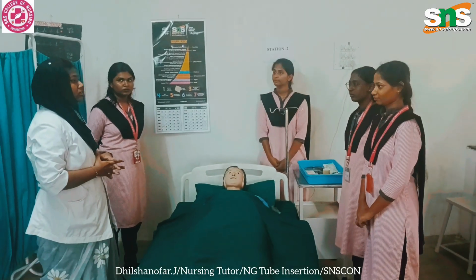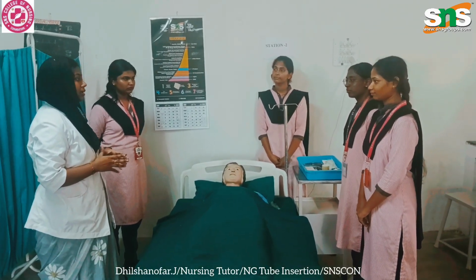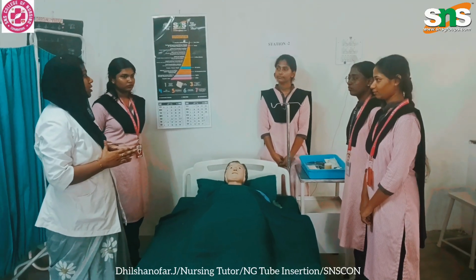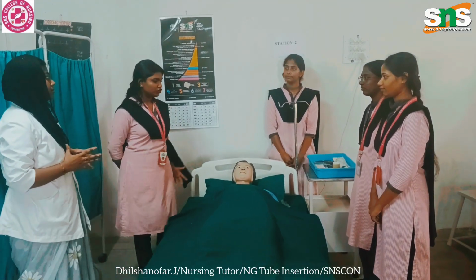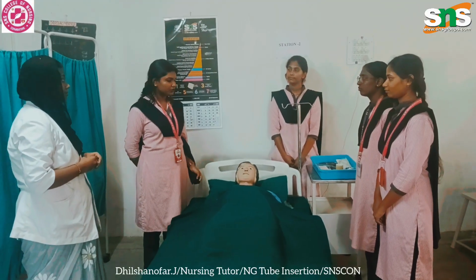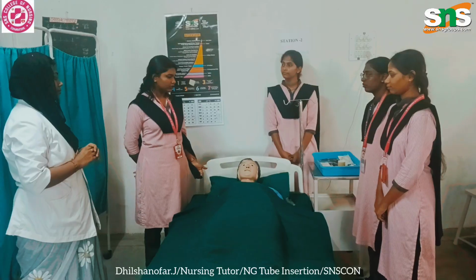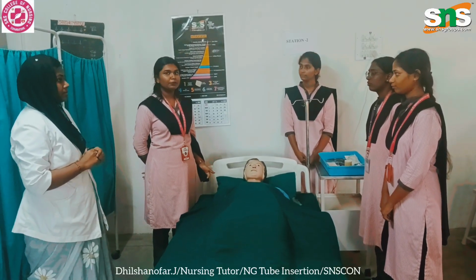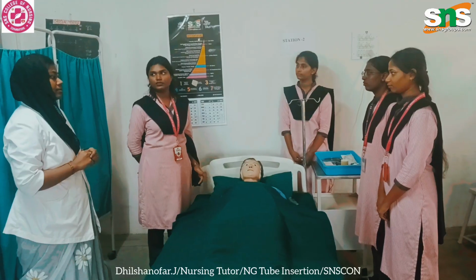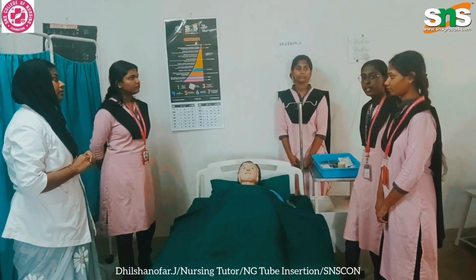Good afternoon everyone. Today we are going to see about the procedure Naso-Gastric insertion. So what is Naso-Gastric insertion? Naso-Gastric tube insertion is a method of introducing a tube into the stomach through the nose. It is a common nursing procedure used to provide nutrition and administer medication in patients who are unable to take medications and food.